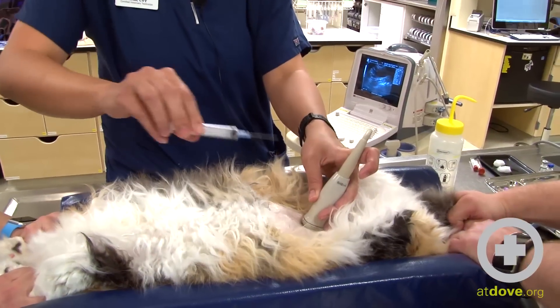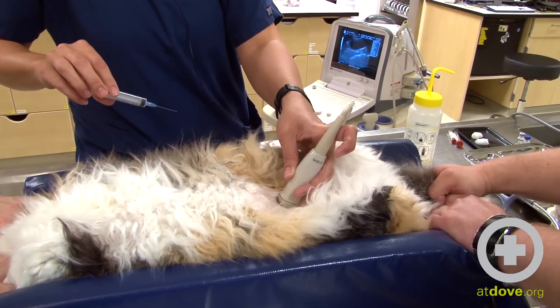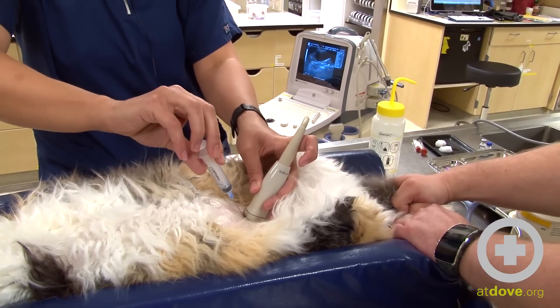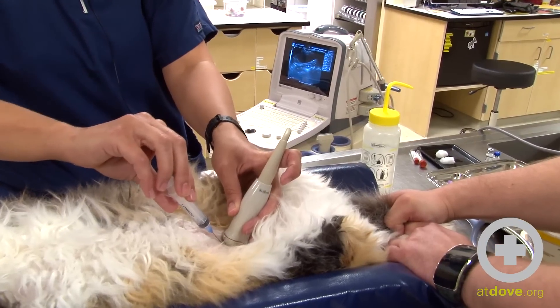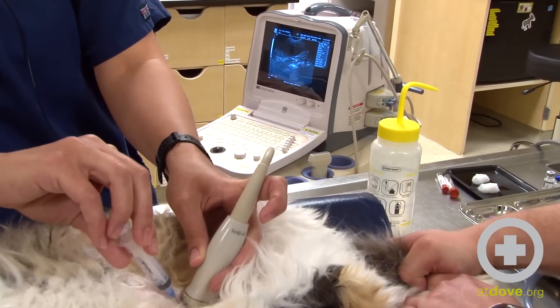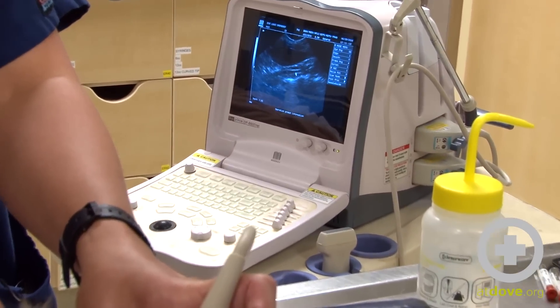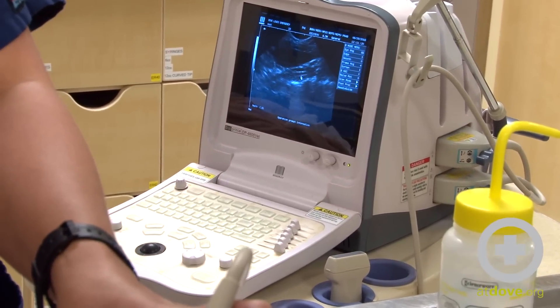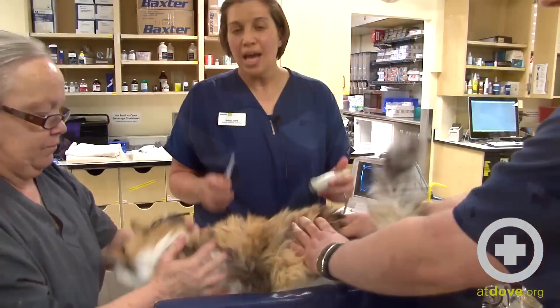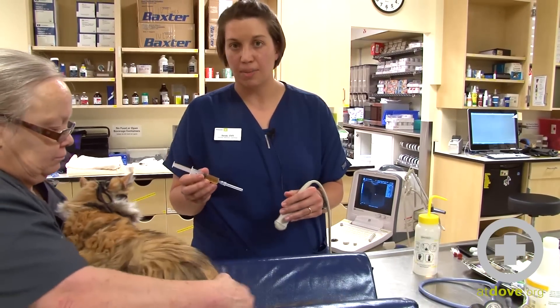I'm going to take my needle and put it underneath the probe to where her bladder is on the screen, watching my screen for the needle to appear. Now that I'm in the bladder, I'm going to aspirate — and you can see that I'm getting urine. Morgan started moving so I removed my needle so that the motion didn't cause any trauma to the bladder.